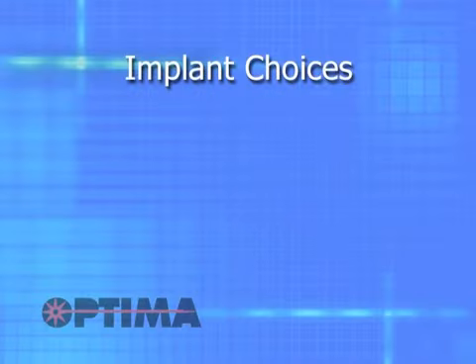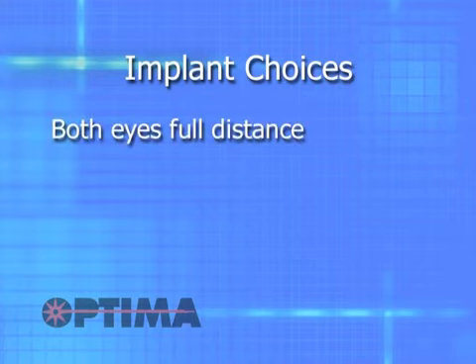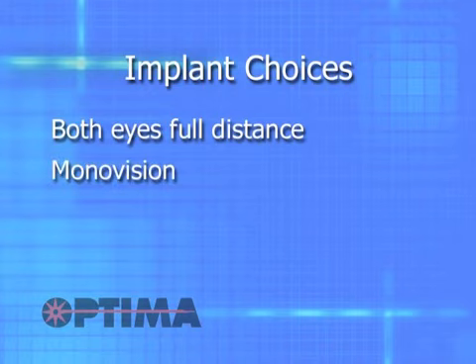So here's a brief overview of the choices. First of all, we can make both eyes for full distance, in which case, for computers or reading, you need to wear glasses for those intermediate and near tasks. Alternatively, we can do what's called monovision. That is, we can do one eye for the full distance and the other eye for near. And that works pretty well, although some people don't like it, and that may not sound good to you.